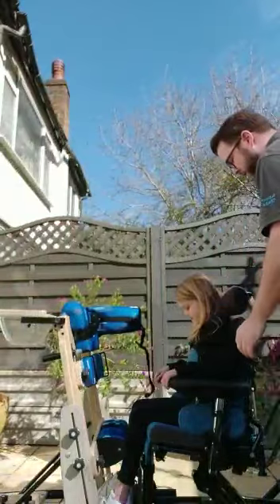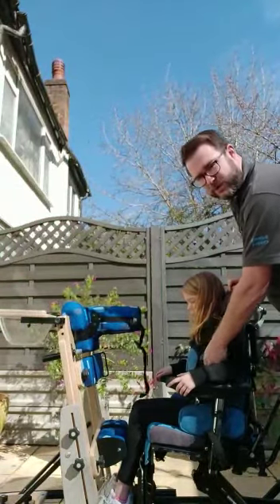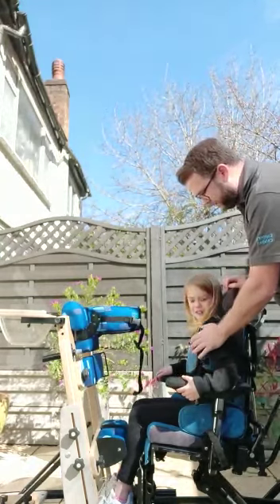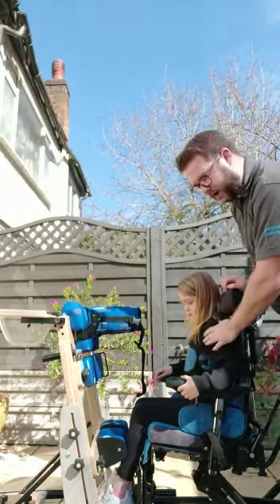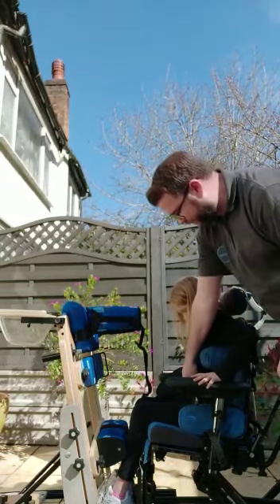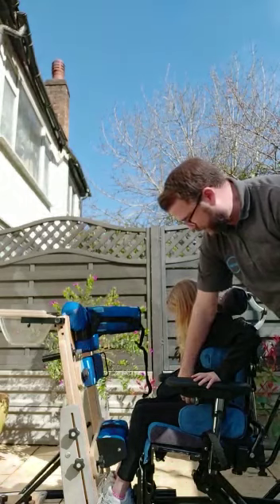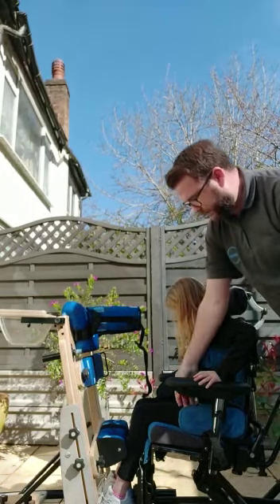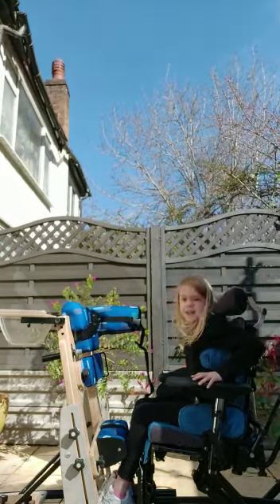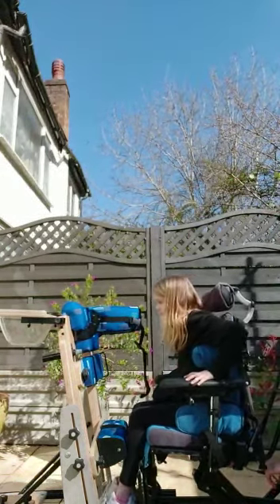From here, we're going to undo Bella's chest strap first — always do the chest or harness strap first, whether it's a chest one or a shoulder harness. Then we're always leaving the pelvis till last — that would be last off. If you need to, you can also use the tilt function to tilt Bella forward.